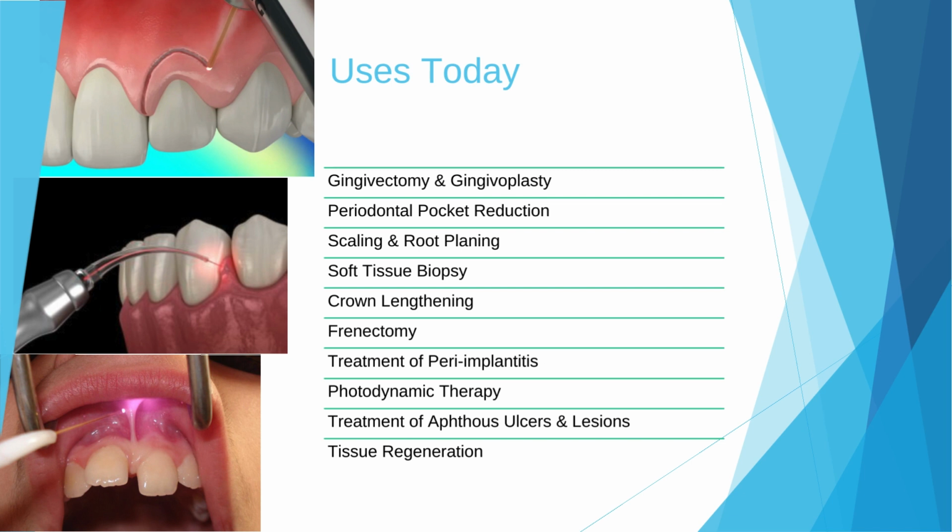And lastly, tissue regeneration. The use of lasers can promote tissue regeneration, especially when combined with other regenerative methods. This is particularly important for treatments meant to encourage the regeneration of periodontal ligament and bone.